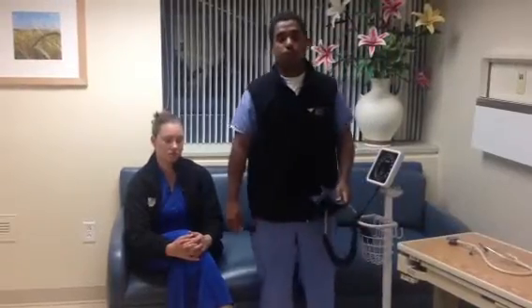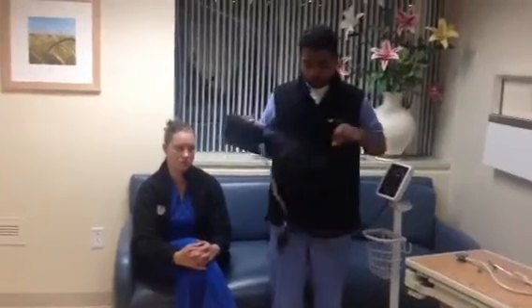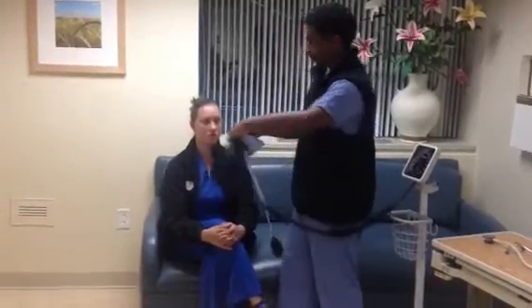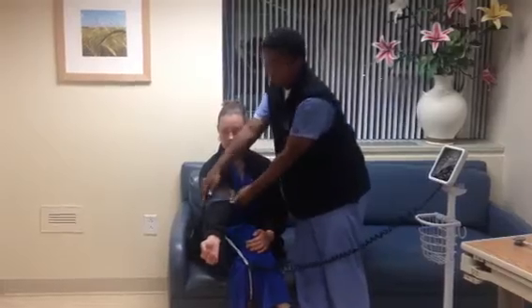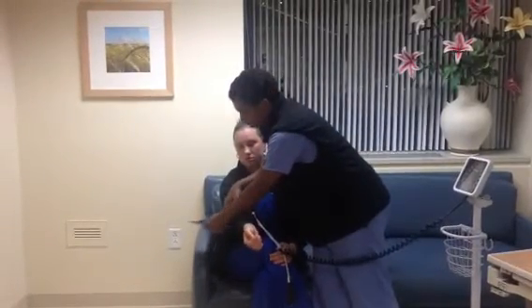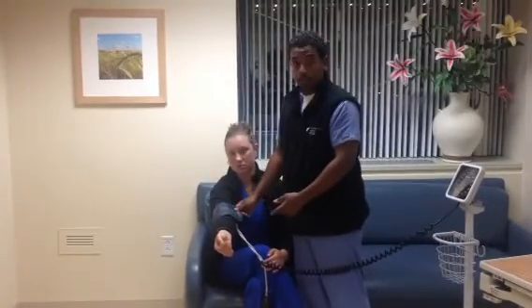When taking a manual blood pressure, it is very important to have the proper cuff. In order to figure out what is the proper cuff, a cuff usually comes with a measuring label on it. You will place this measuring label on the patient's arm and make sure the patient's arm is within the two measurement lines. Another way of figuring out the proper cuff is placing it over the arm and seeing if it wraps around about one and a half times. As I did just now, this cuff is a proper cuff for this patient.